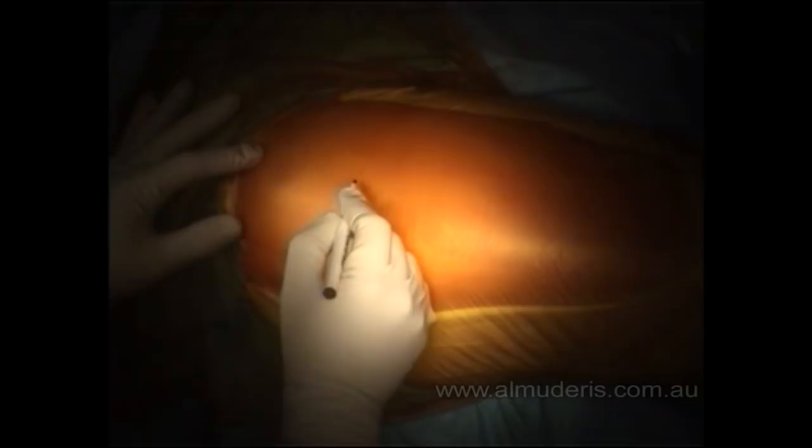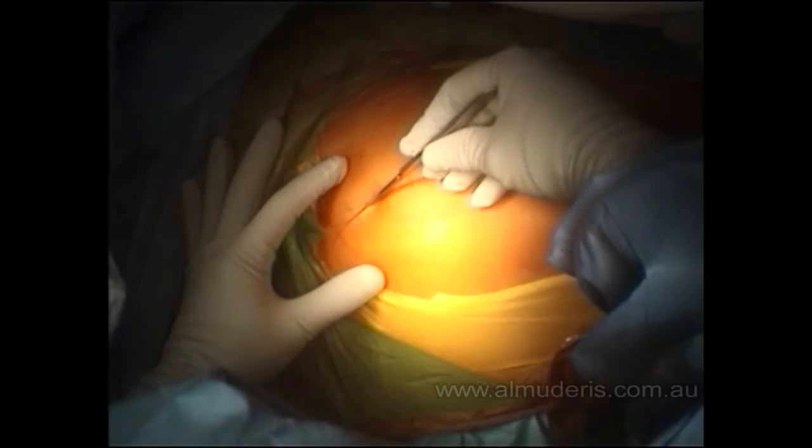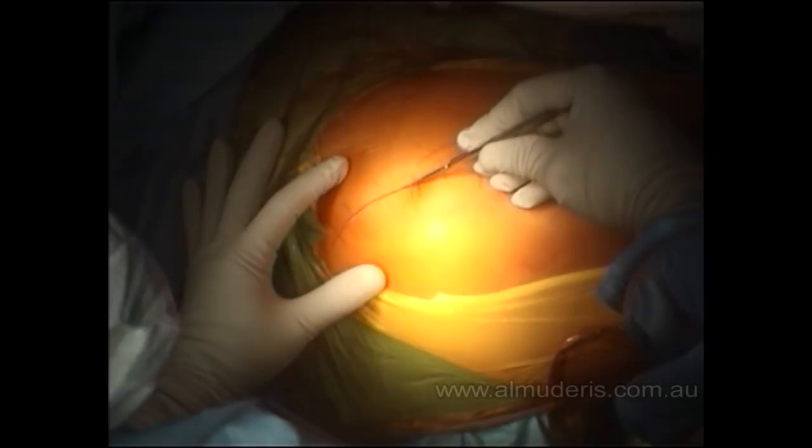The whole team change their gloves. We mark the landmarks: the greater trochanter, anterior superior iliac spine, and the sacrum. The incision goes alongside the greater trochanter, curving posteriorly toward the posterior superior iliac spine — an incision ranging around 8 to 10 centimeters.